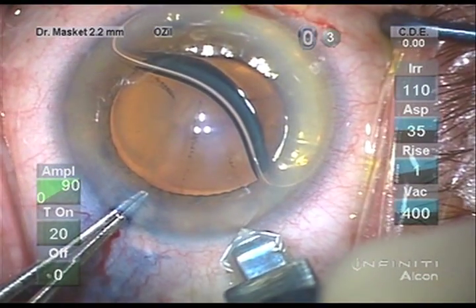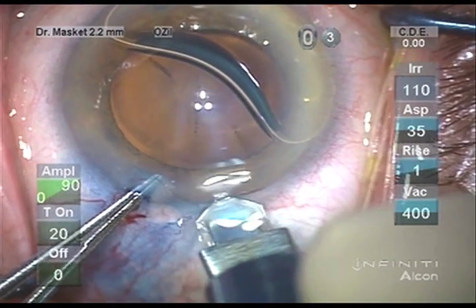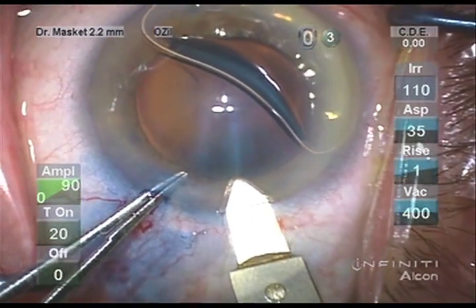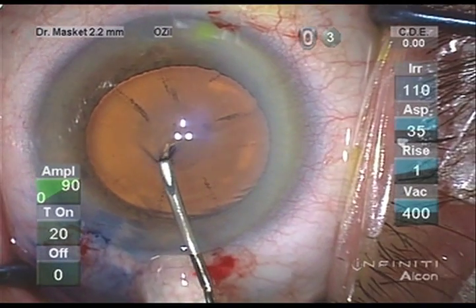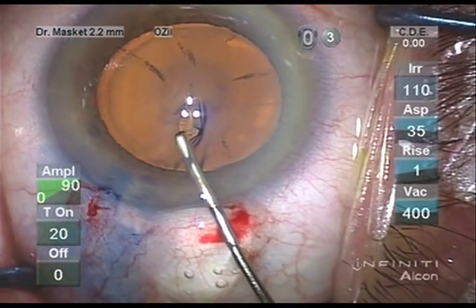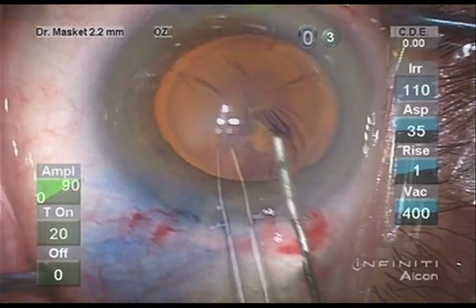I prefer working through a 2.2 mm system for its fluidic advantages. A 2.2 diamond blade creates a corneal tunnel incision. Working with the cystitome, one can see the marked weakness of the zonules and wrinkles of the capsule which follow suit.